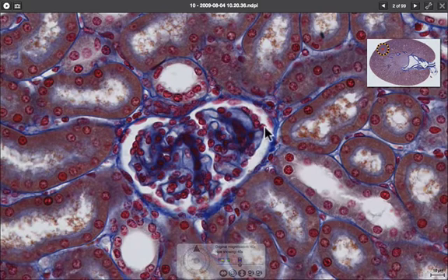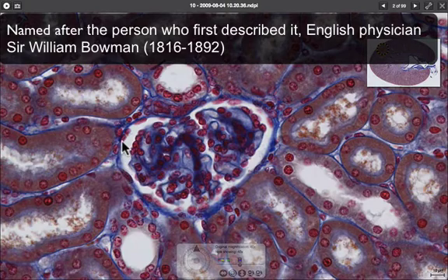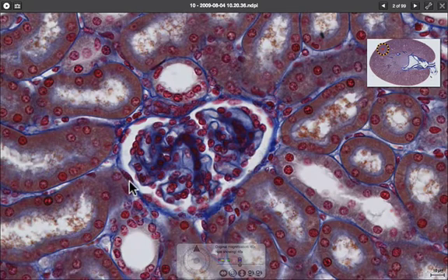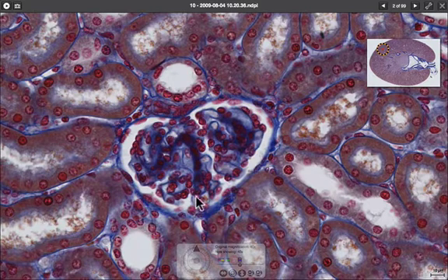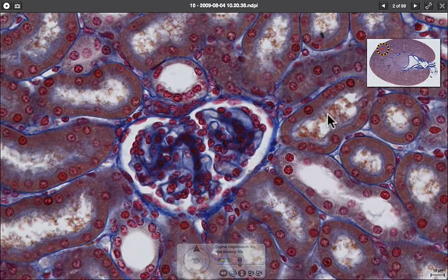The filtrate then goes into Bowman's space, which is lined with flat epithelial cells — squamous epithelial cells called the parietal epithelium of Bowman's capsule. From there the filtrate goes into a proximal convoluted tubule, which has specialisations of long microvilli to help with reabsorption.